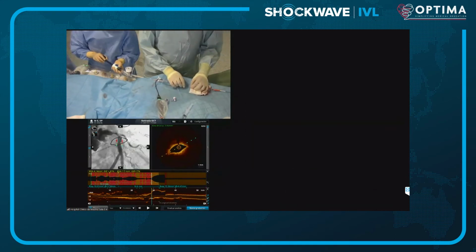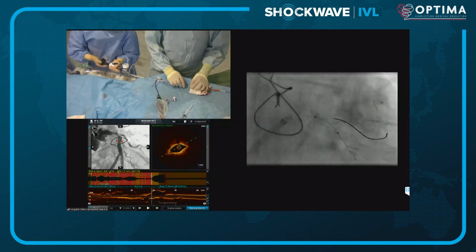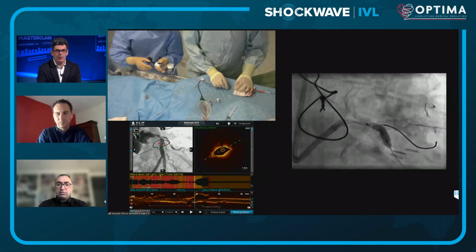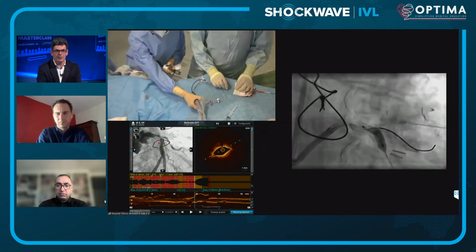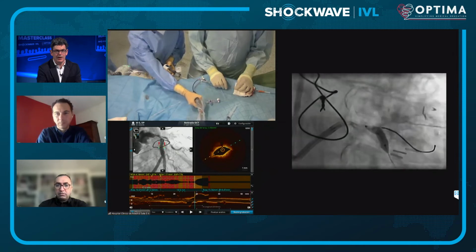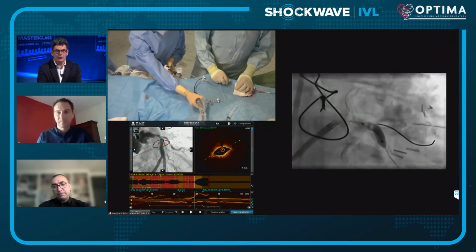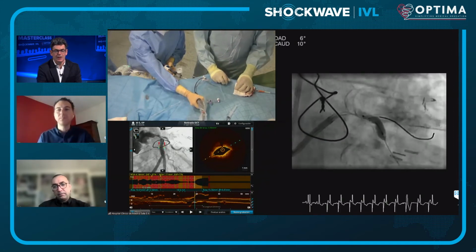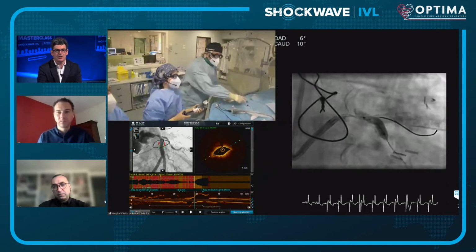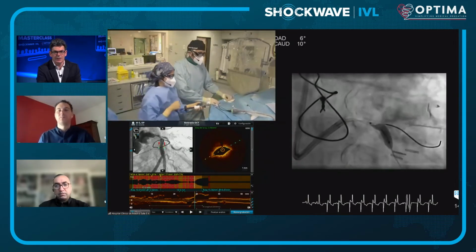Okay. Good. So we go there and just first in fluoroscopy, go to 4. Okay. Yep. So it already actually looks to be more inflated in that proximal segment, not completely yet. Yeah. Much better. It opened a lot already, which suggests that there was significant concentricity in that region. And I think you'll have another region more proximally of concentricity, so when you move the balloon back for the next shockwave sequence.